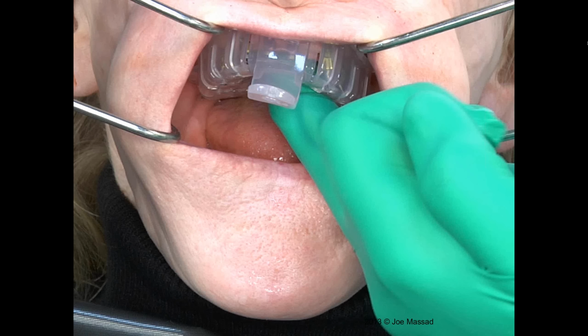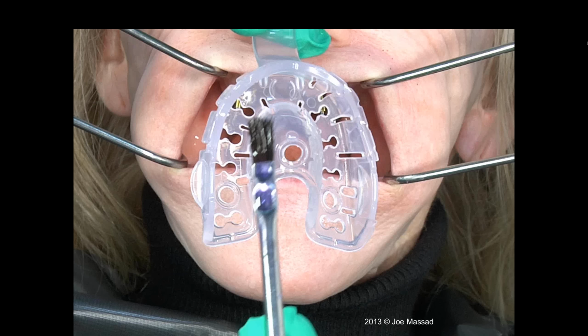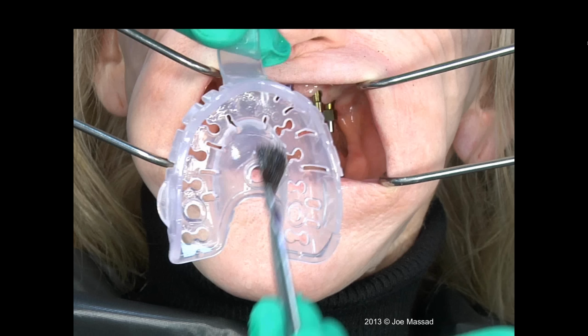Now, what we're going to be doing here is putting adhesive on the inside portions of the tray and on the palate. If you noted, this particular patient has edentulous ridges in the posterior area, so virtually nothing posterior to the second molar. So we have edentulous areas, and then in the anterior, we have the 6 implants. So I'm now going to utilize a very rigid PVS impression material to make tissue and implant stops.